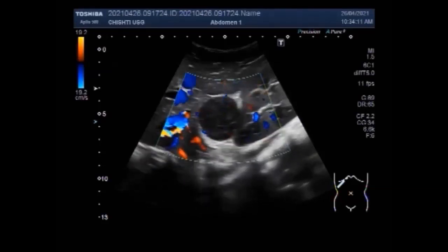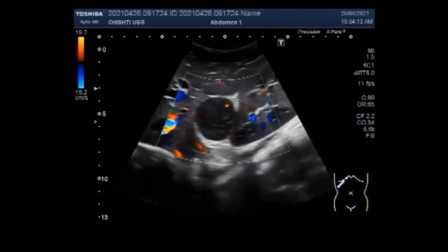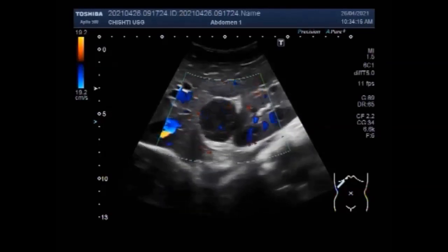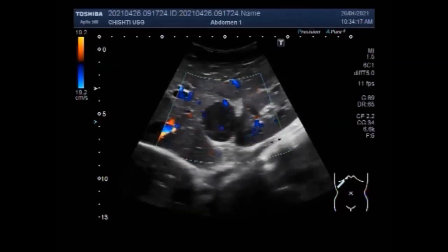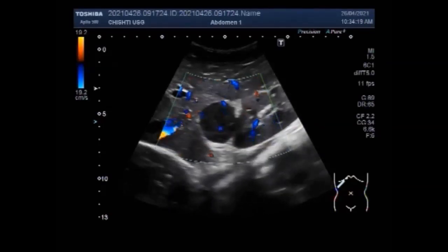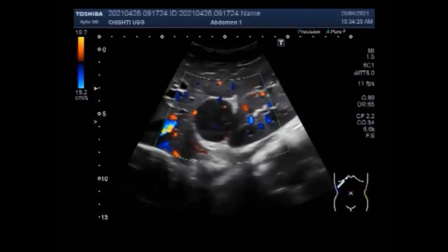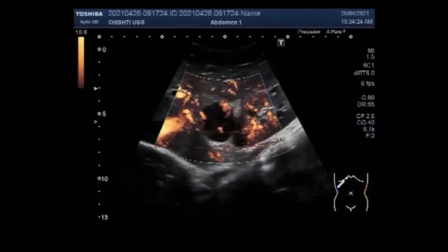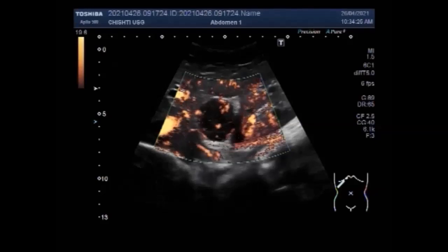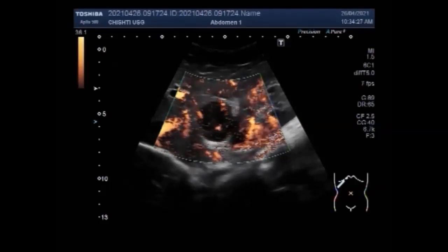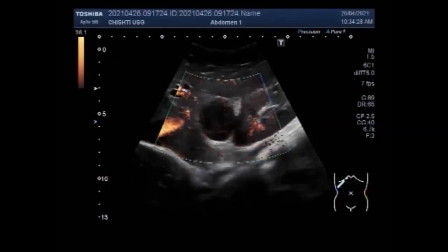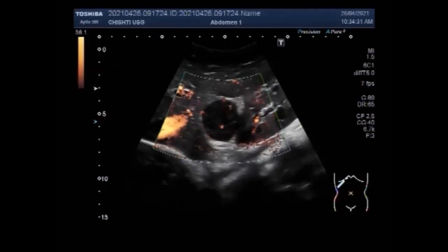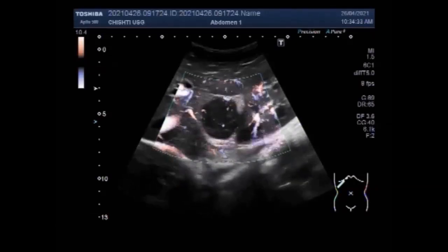Now you can see the blood flow. Significant blood flow is seen in the kidney, liver, and the mass. The mass is round to oval in shape, semi-solid to solid in consistency. No fluid is seen in or around the mass.